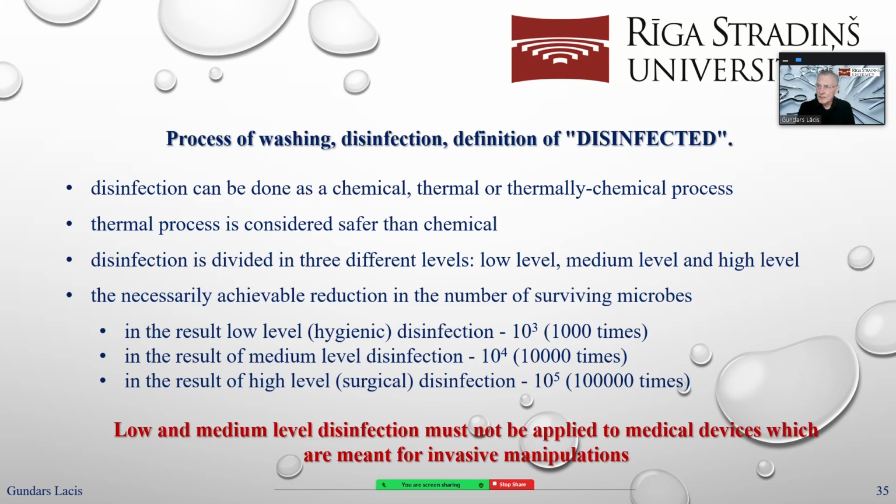And one more thing that is really important: low level and medium level disinfection is not allowed for medical devices or surgical instruments which are intended for use in invasive manipulations. Yeah, and one more thing. Alcohol is a low-level disinfection agent. That you have to remember.